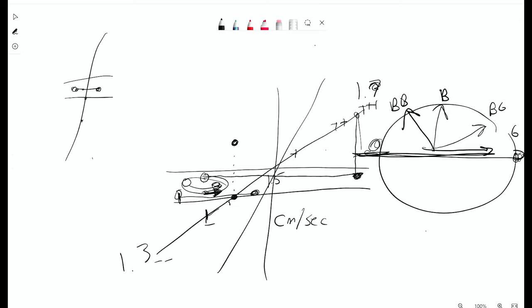Nice. So in this case, phase contrast wise, you don't have to worry about that 15 degree angle because of the technique. But what you do have to think about is making sure your Venc is appropriate. Ideally, your Venc needs to be just higher than the maximum flow. So can you have multiple Vencs for each direction? You can. Yeah, totally. It's called free mode. You can go through and say left to right, I want the Venc to be 30 centimeters per second. Nice. That kind of thing.